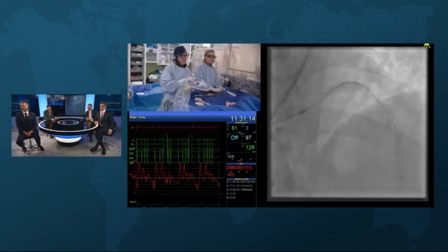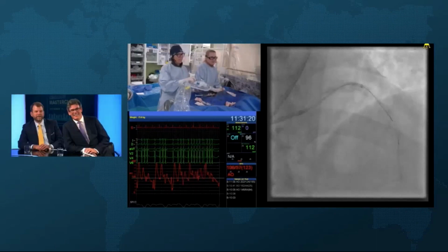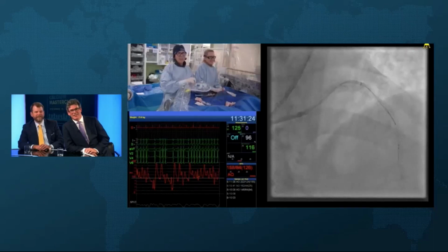There's a few bends in the back end of that IVUS catheter, I assume. Oh, you can see that, though. Very good. I've just done it enough times to know that you've made yourself probably a hand grip at this point with the back end of the catheter.